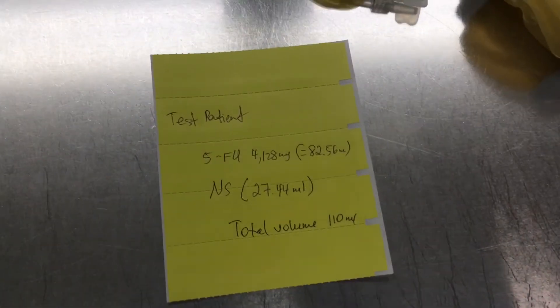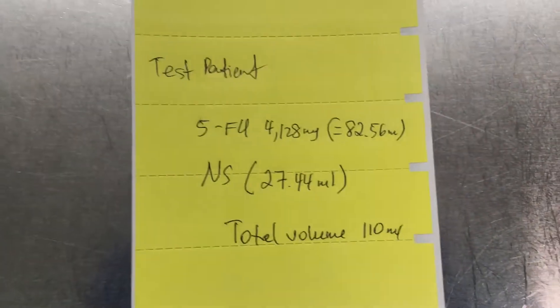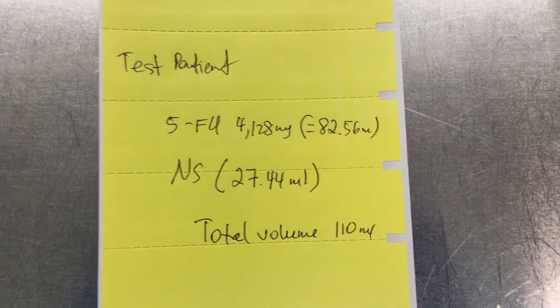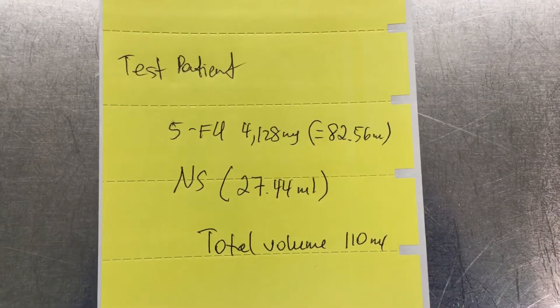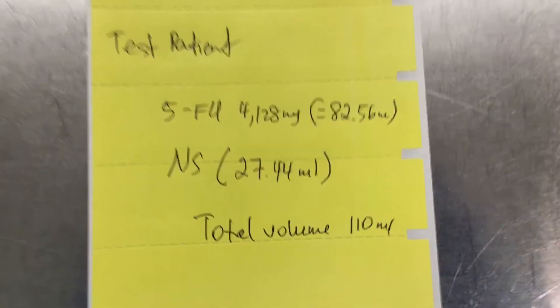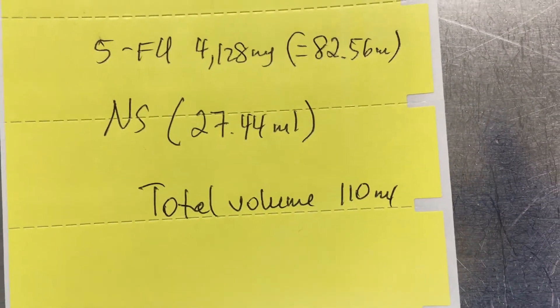In this video, we're going to demonstrate how to prime and load an elastomeric pump. This is the test patient label that shows you the volume of 5FU, the volume of NS, and the total volume, which is 110 ml.